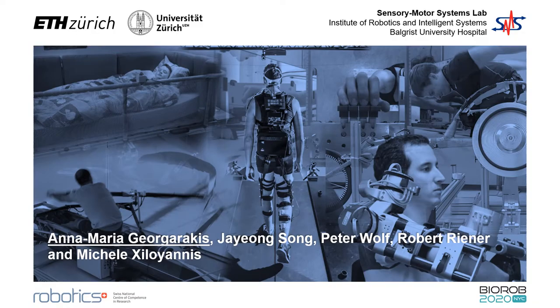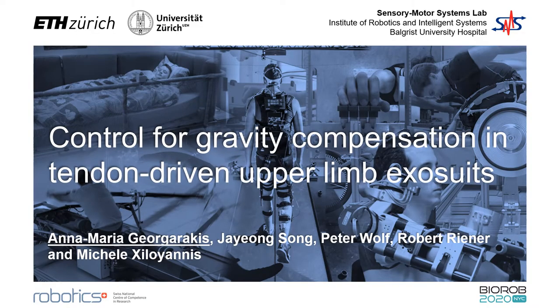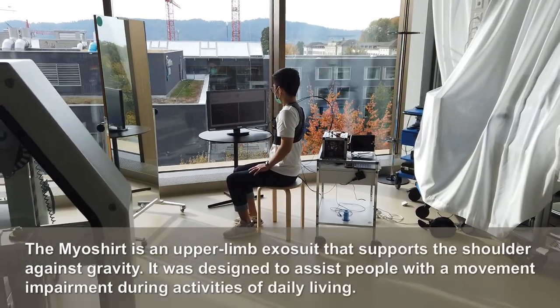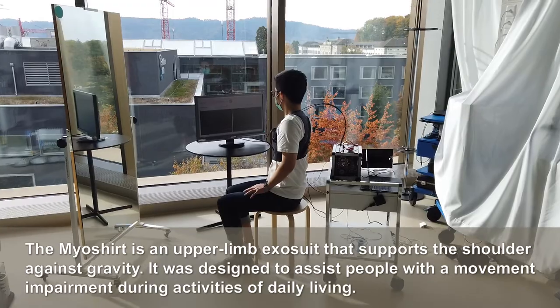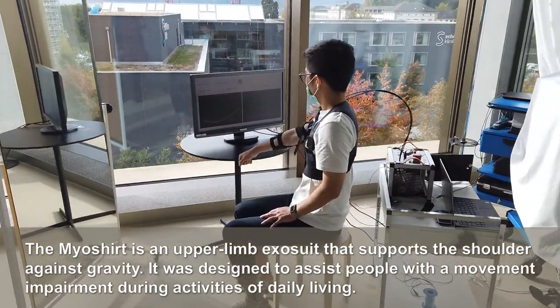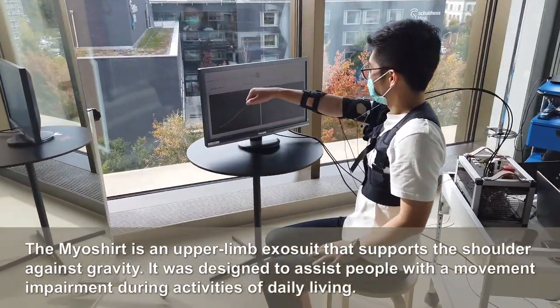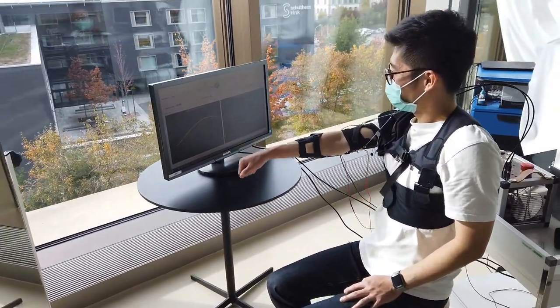Hi, I'm Marie. I'm Jake. And today we are presenting to you the research that we did while developing the Myoshirt. The Myoshirt is an upper limb exosuit that supports the shoulder against gravity. It was designed to assist people with a movement impairment during activities of daily living.